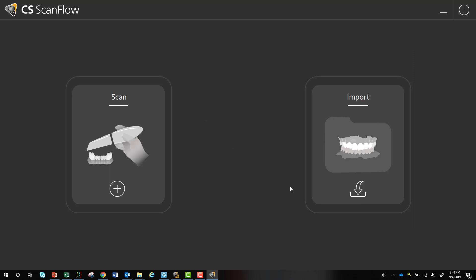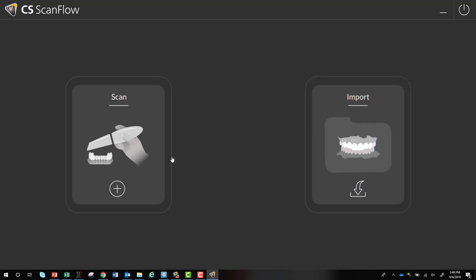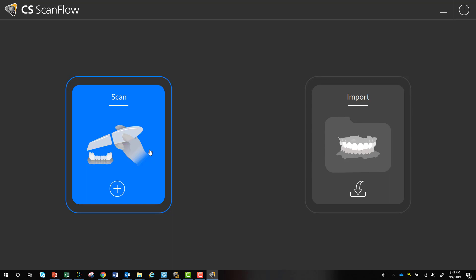What you're used to seeing on your initial screen are the restorative, orthodontic, implant, and import icons, which forced you to choose your workflow before scanning. The problem is you're limited to the features within that particular workflow. With ScanFlow, you simply select scan or import an existing scan and choose your workflow later on the fly, making all software features available for any workflow.